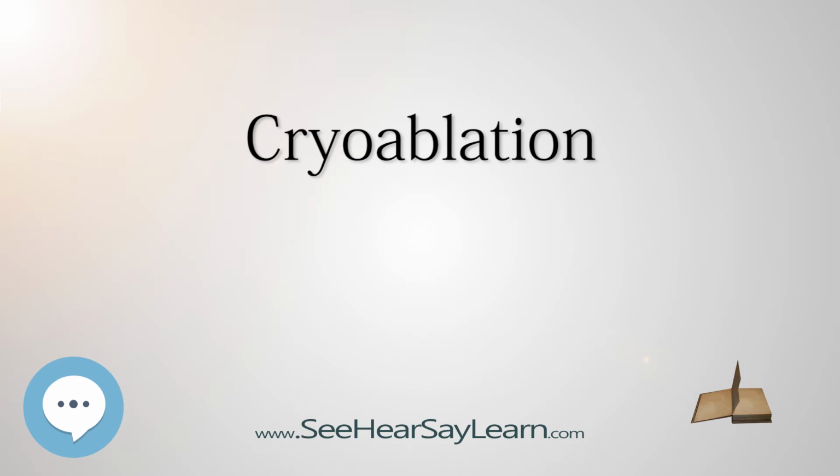In 1964, Dr. Cahan successfully used his liquid nitrogen probe invention to treat uterine fibroids and cervical cancer. Cryotherapy continued to advance with Dr. Amoils developing a liquid nitrogen probe capable of achieving cooling expansion, in 1967. With the technological cryoprobe advancements in the 1960s, came wider acceptance and practice of cryotherapy.